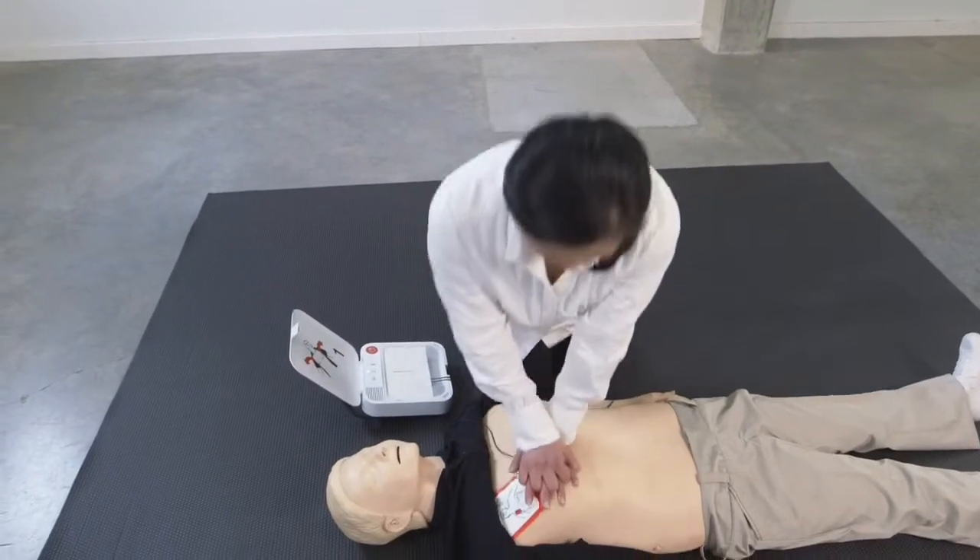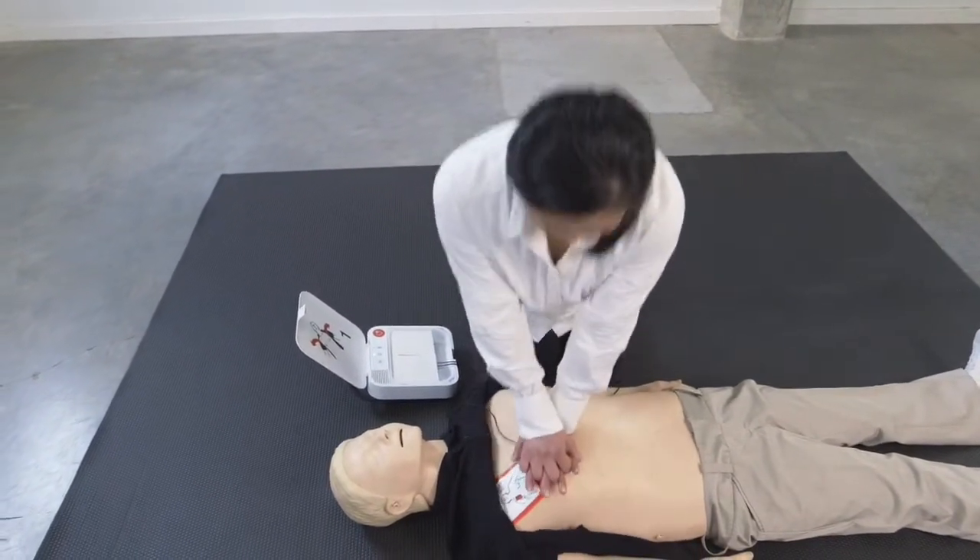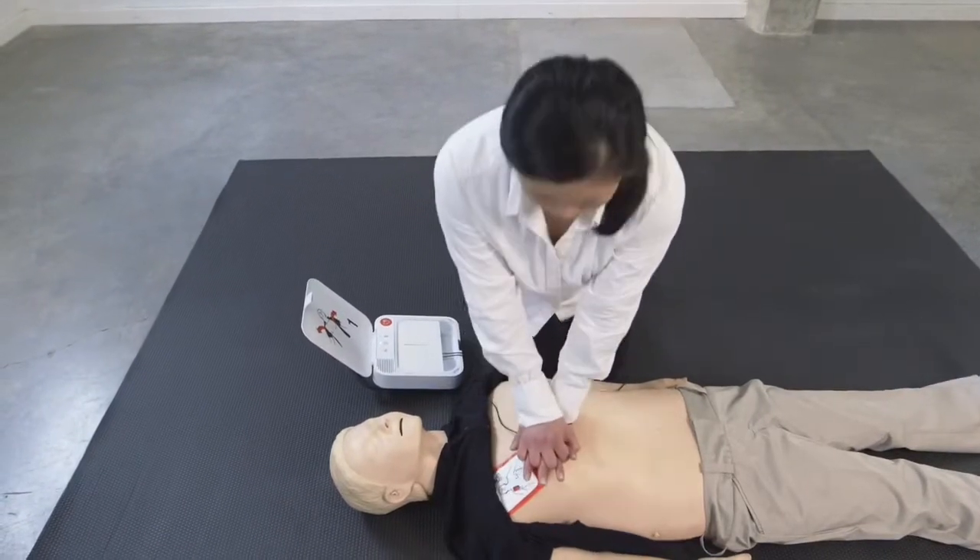Resume chest compressions. Lean over the patient. Keep elbows straight. Use body weight to push.